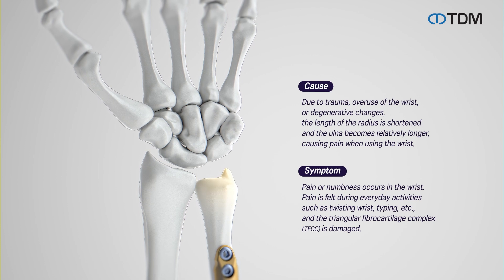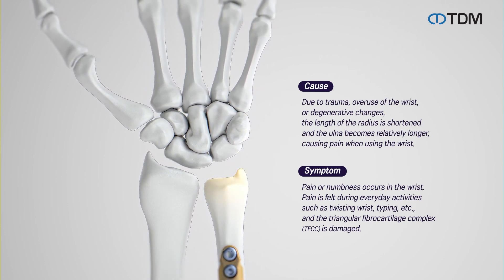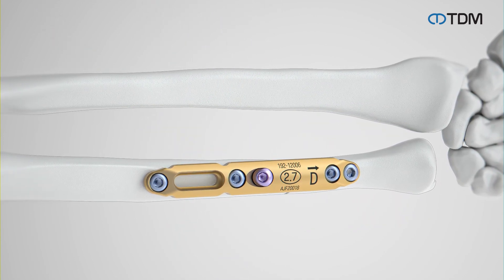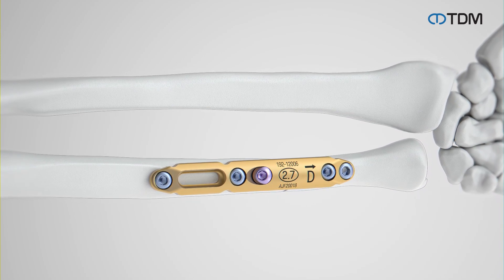The ulna shortening system is used for ulnar shortening procedures in cases where there is a significant difference in length between the radius and ulna due to trauma, excessive use of the wrist, or degenerative changes causing the radius to shorten.